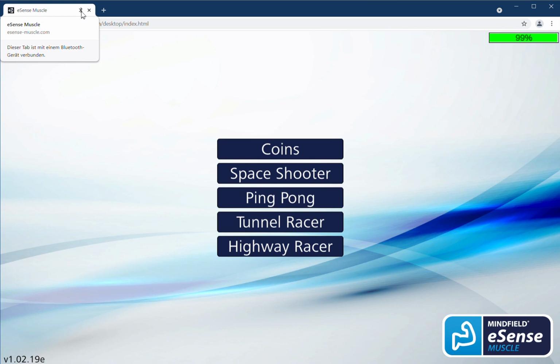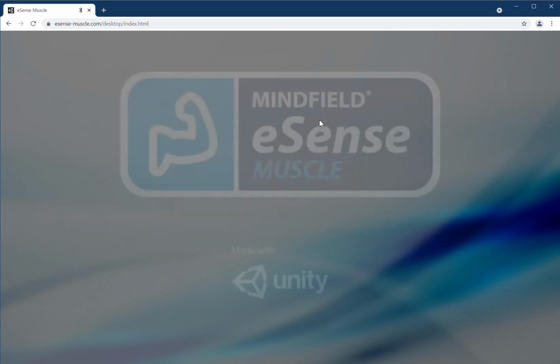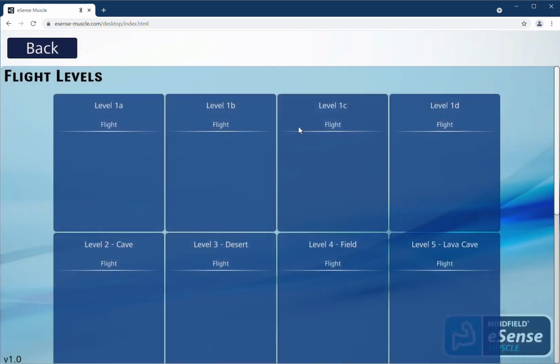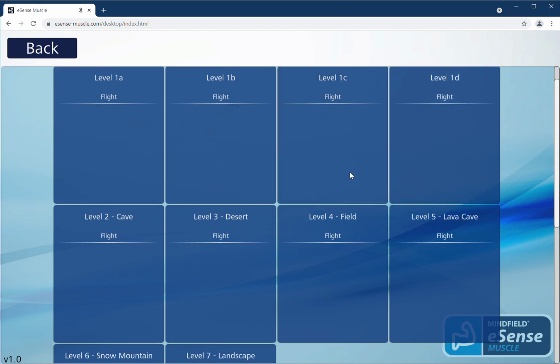You see here there's a little Bluetooth icon. It says, oh, so this is already connected here. I show you the coins game, clicking on that, load it, because it's one of the nicest we have. It's a game where you need to collect coins with your muscle activity, and first you need to choose some levels. You can have a look at them all. They're all different background, different arrangement of coins, different music.